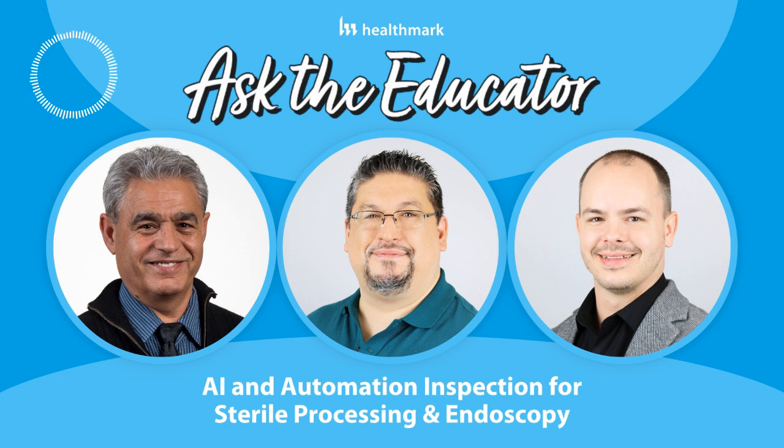Always look at common sense first: does common sense allow you to do that? But obviously we need some kind of consensus standard or guidance. Today, if you look at the Food and Drug Administration, the Centers for Disease Control, SGNA, AAMI, and AORN, they all have guidance on processing based on quality improvement, quality assurance, and monitoring of the process.